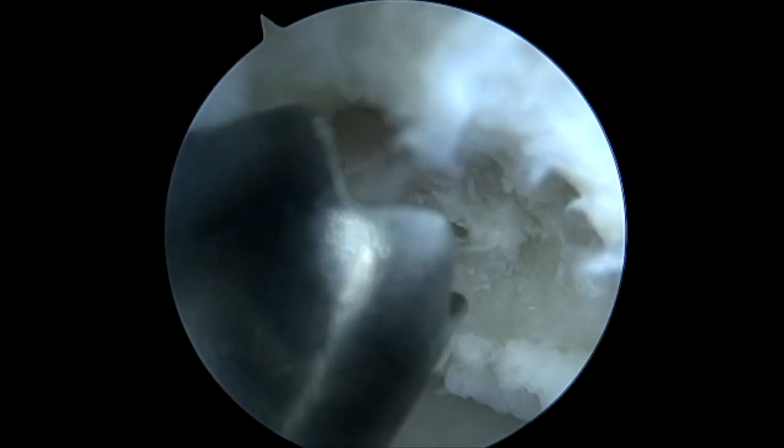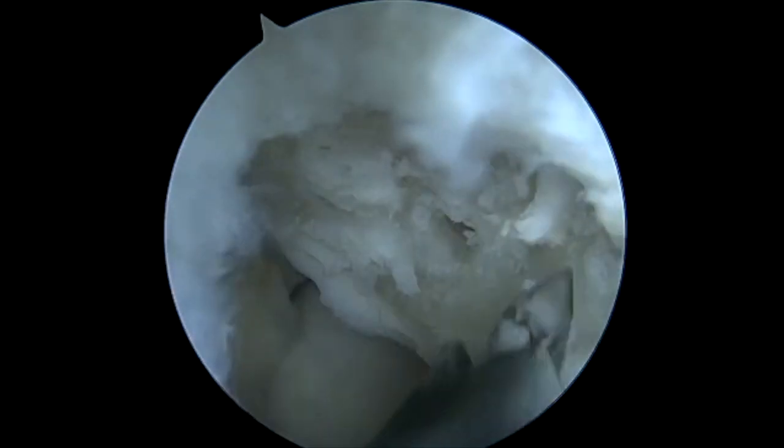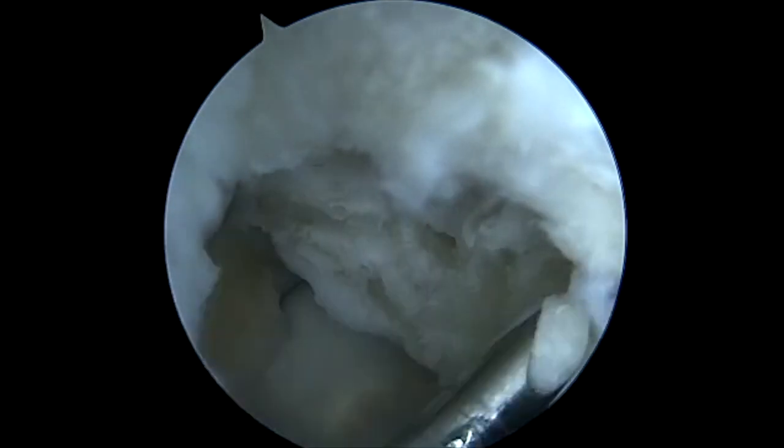This will stimulate fibrocartilage and in most cases for these OCDs this is sufficient to take care of their pain and other further issues. If anything further is needed we would consider cartilage transplantation, but for now this should be adequate, and in most cases it is.